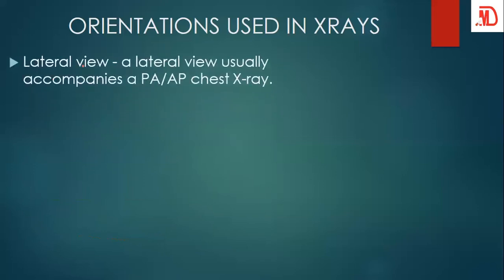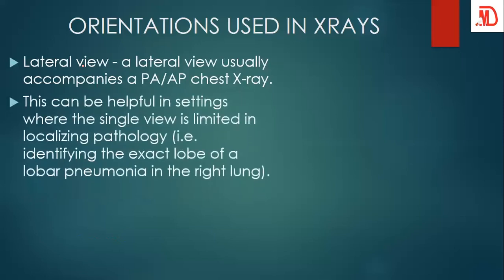Still on the orientation, we have the lateral view. As I said, we have three, so the lateral view makes it three. With the lateral view, it is not used alone. It comes with either a PA view or an AP view. The reason we add the lateral view is because it helps in cases where we cannot localize the pathology with just a single view. With just AP or PA, maybe you can't find the exact place where the problem is happening, but if you take the lateral view, at least it helps you to pinpoint exactly where the pathology is. So it's very good to have a lateral view as well.